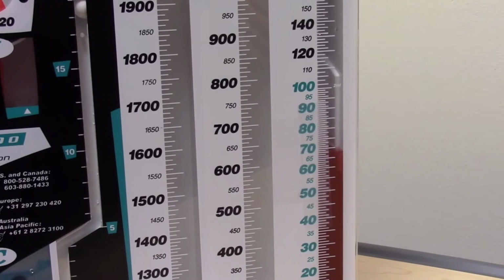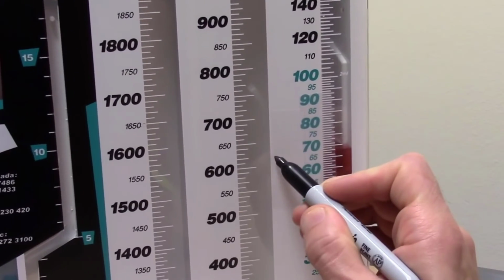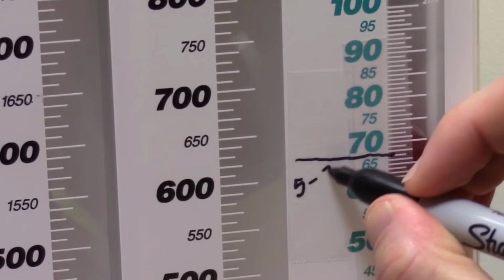Next, assess the quantity and quality of fluid in the collection chamber. Clearly mark the level of the fluid and mark the date and time.